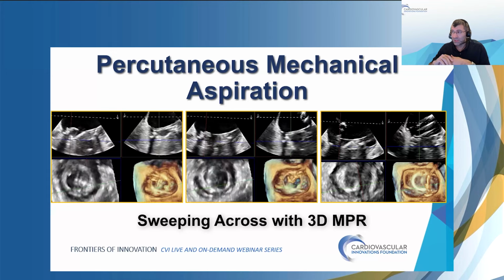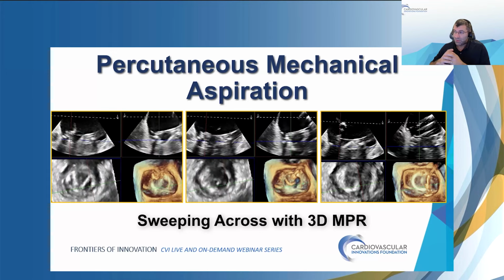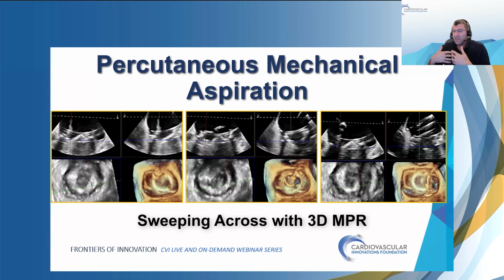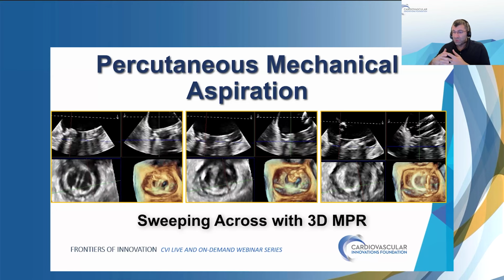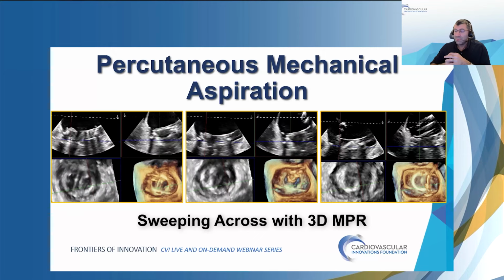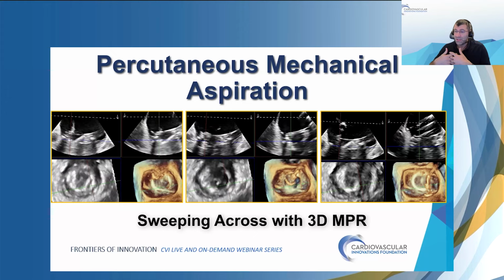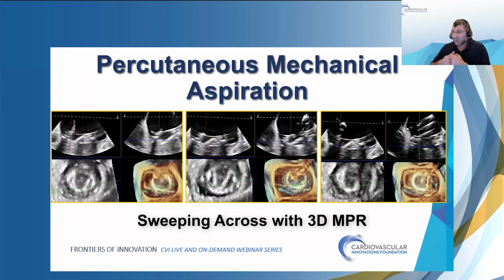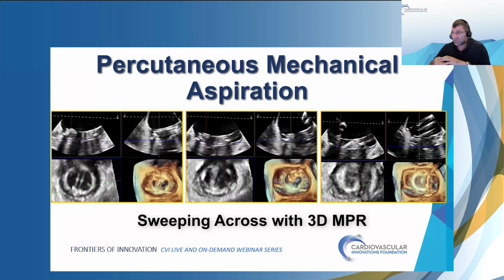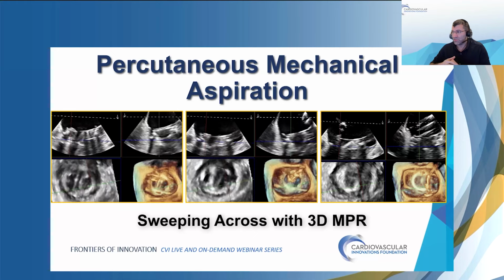The other point that comes up all the time is, where do you return the blood on the left side when you're doing left-sided cases? For me, I almost always return to the vein, because they're short runs and they're tolerated. But in some patients who have concomitant valvular disease or stenosis, who may have profound hypotension, or have had a significant stroke where we don't want hypotension, sometimes returning to an artery avoids that hypotension altogether. So that's just a little bit of a tip.